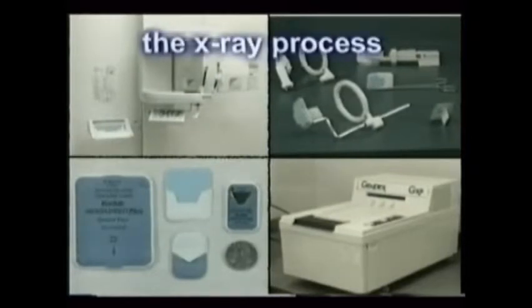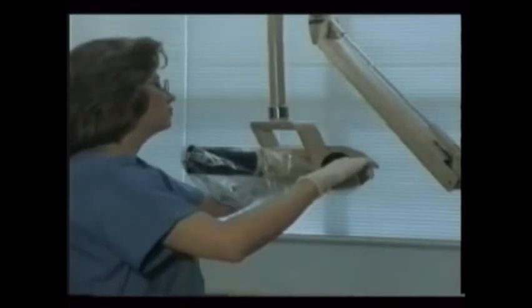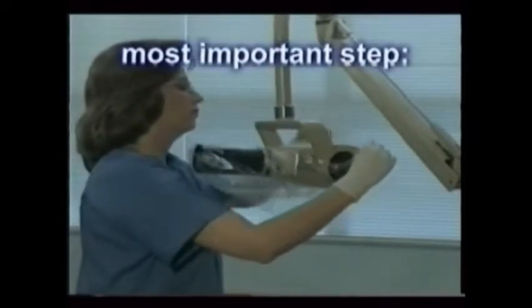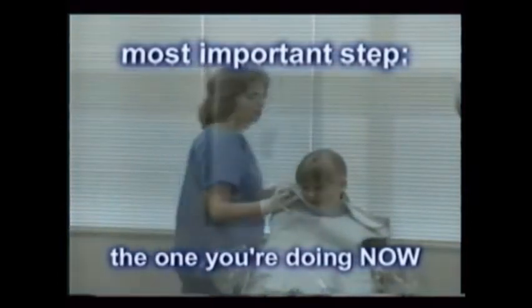The entire process of making dental X-ray films involves using 4 groups of equipment: the X-ray machine, the X-ray film, film holders, and developing chemicals. The number of steps throughout seems infinite, each blending with the next. It's very important to remember, though, that the most important step during the X-ray process is the very step you're doing now. A seemingly minor error at any step of the process may render a film unusable.